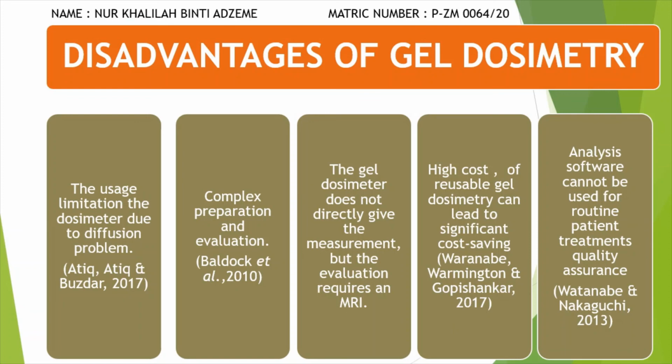Besides, the next consideration is about availability of the analysis software to process the raw data to the 3D dose distribution. Most research groups in the gel dosimetry field develop their own data analysis software. However, the analysis software cannot be used for the routine patient treatment quality assurance, but are excellent tools for the research related to the new equipment and delivery technique.